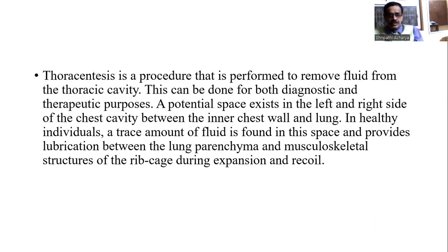Thoracentesis is a procedure that is performed to remove fluid from the thoracic cavity. It can be done for both diagnostic and therapeutic purposes. A potential space exists in the left and right side of the chest cavity between the inner chest wall and lung. In healthy individuals, a trace amount of fluid is found in this space, which provides lubrication between the lung parenchyma and musculoskeletal structures of the rib cage during expansion and recoil.